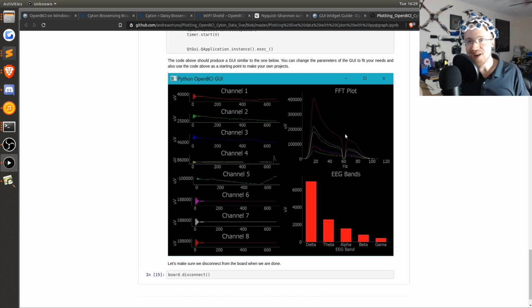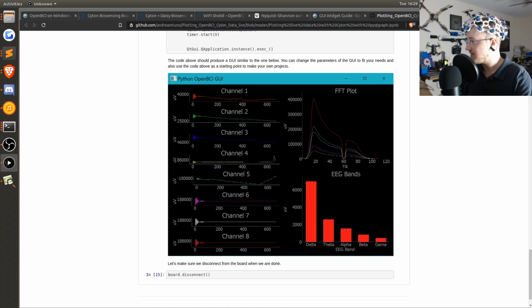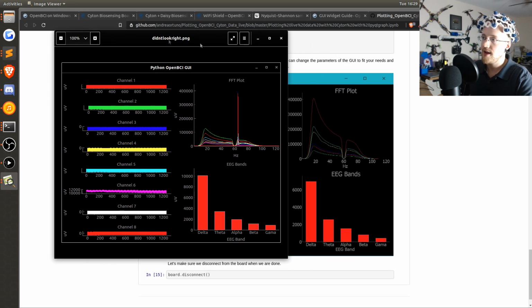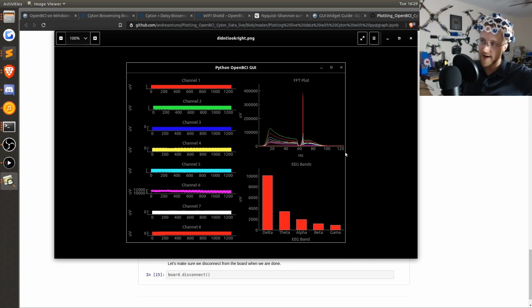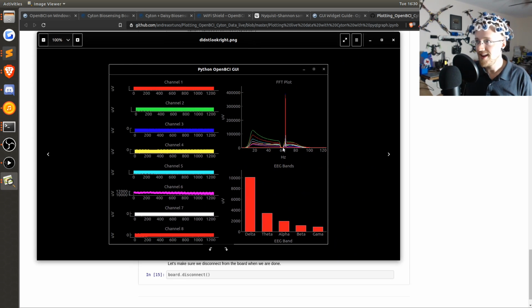But also I was like, oh, this will have the FFT code, and I can just use that, right? So I was like, okay, great. So I did try it, and actually let me keep this up. One of the issues I faced was when I ran that, this is what I got. And obviously there's a couple of major issues here. First of all, with EEG data, you want to do two things. You want to filter out things that are outside of the ranges that you're expecting to actually receive, so you use a bandpass filter. Sorry if I butchered that. There's probably people cringing right now. And then you also want a notch filter, to filter out the 60 hertz noise. All the electrical equipment is just screaming out 60 hertz noise, so you just get rid of it because it's useless. As you can see here, they've notched that away. But for whatever reason, in mine, the 60 hertz noise got filtered out, but it looks like I've got a huge 63 hertz noise, and that was always there. It's not like that was a one-time fluke.